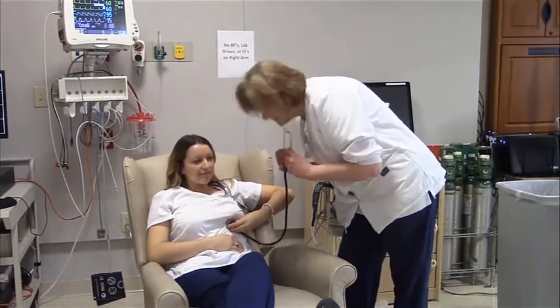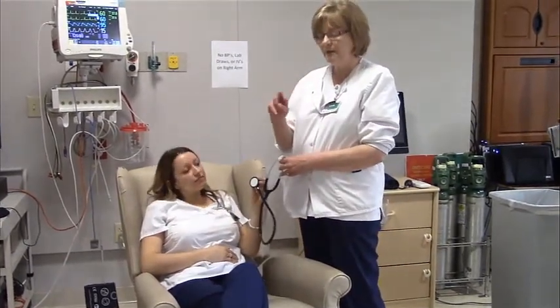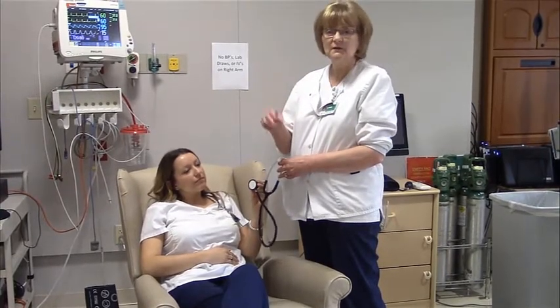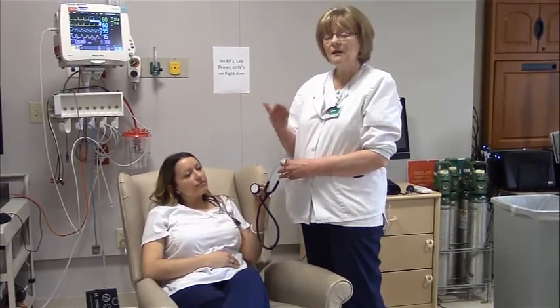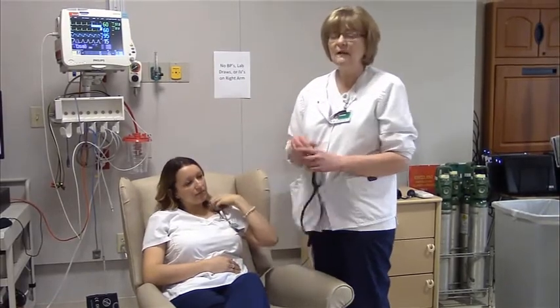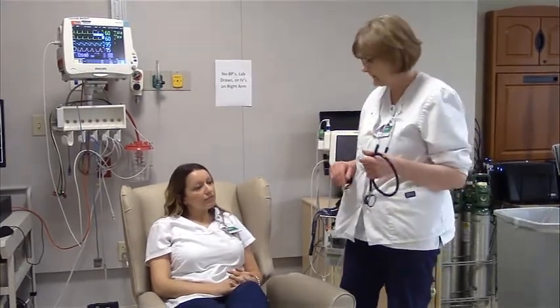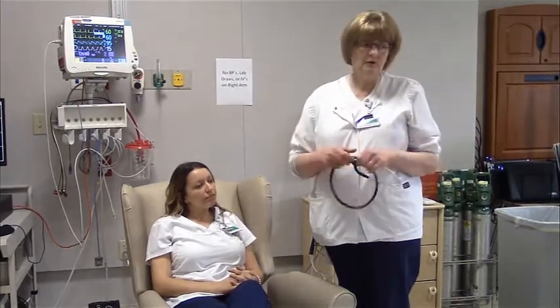So you're in there, you're listening to the heartbeat, and what you're listening for is 2 sounds, lub-dub, lub-dub. Lub-dub is 1, lub-dub is 2. You're going to have to get a rhythm going before you start counting. And then once you get that rhythm, you'll count for 1 full minute. That way you aren't missing any beats. This one does require some practice time, and again, you'll have this available for you during your live class. Okay. So those are your different pulses.